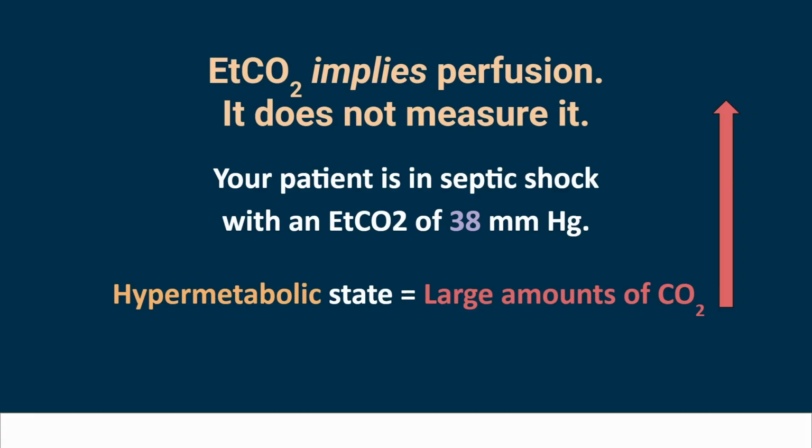You with me? If I got a guy that's having a fever, what would I expect about his end tidal? I would expect it to be high. It may not be based on his situation, but I would at least expect him to be metabolizing quickly. Why would a person with a fever be metabolizing more than when he didn't have a fever? Because he's trying to fight the infection. He's working harder. Excellent. But shouldn't that end tidal be higher? It should. That's a normal end tidal at 38, and if he's in a hypermetabolic state, it should be 48.